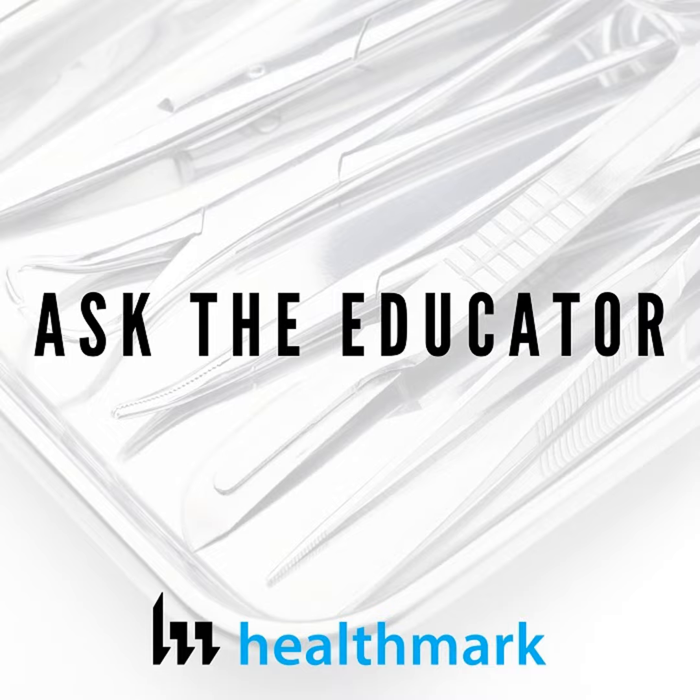And a lot of people just wipe down the outside. They put a brush down that little port, the suction port, and they just sort of hope that that's good enough. But we know that that's not happening. We know that that's not getting properly clean. I don't know if you're seeing that same stuff out there.